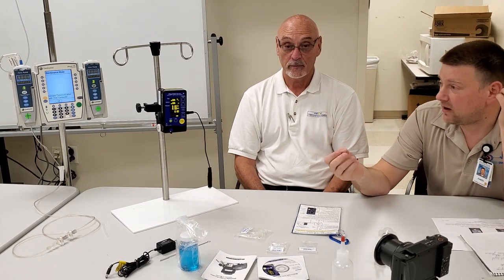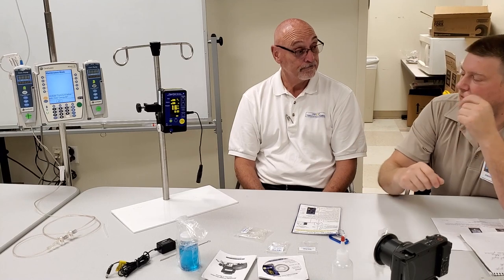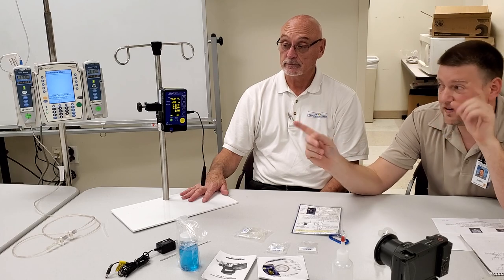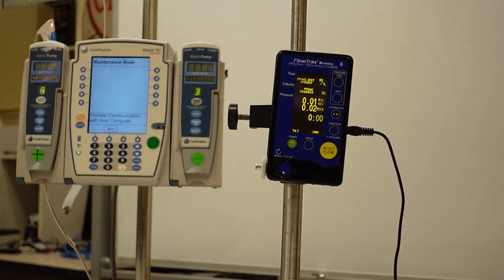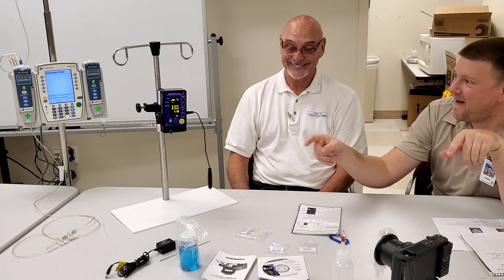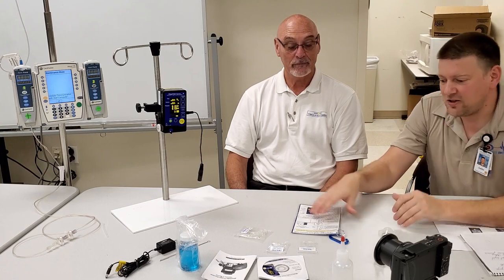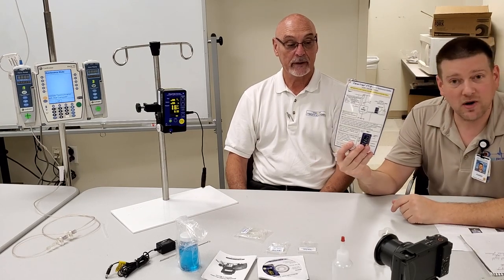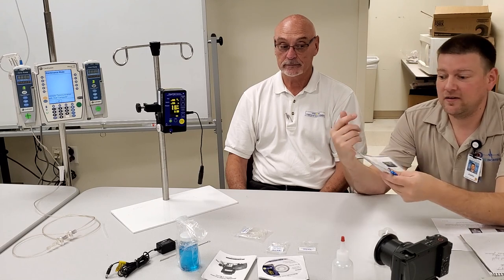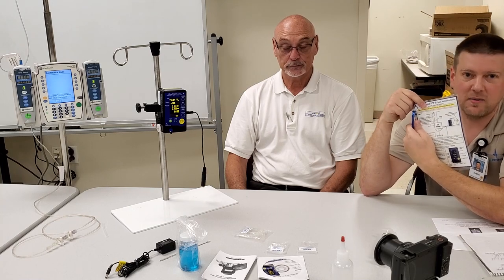Now let's get into the meat and potatoes: this device is a flow meter — it does flow, volume, and occlusion pressure. The unit has a sensor that detects when it's tilted, so when you set it up you need to make sure it's as level as possible; it will tell you when you're off. Mount it at approximately the same height as the infusion pump. Always check with your manufacturer's suggested settings for height and output height when doing a proper calibration.